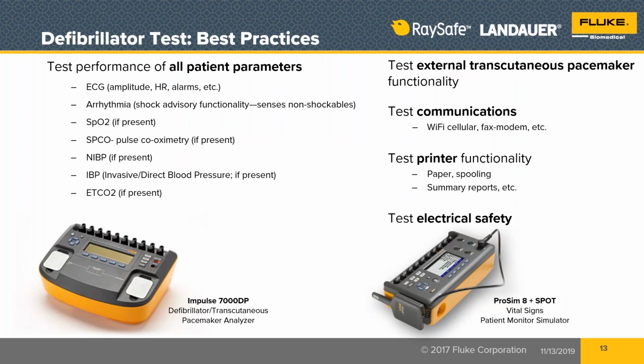All right, so again, best practices. We talked a lot about the output energy testing. One of the things we didn't talk about is a charge time test. That's required in the standard, and most every manufacturer that I've been looking at has also wanted the charge time test to be done. The charge time test is defined as the 15th, that's 1-5, the 15th maximum energy delivery on battery, not plugged into the wall, on battery. And we run the charge time test on that.